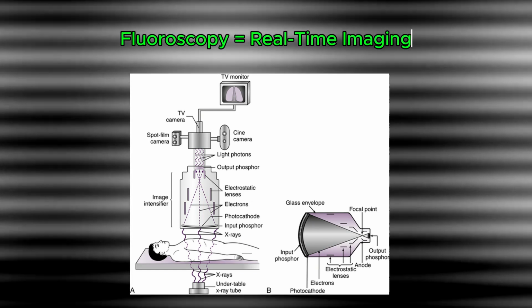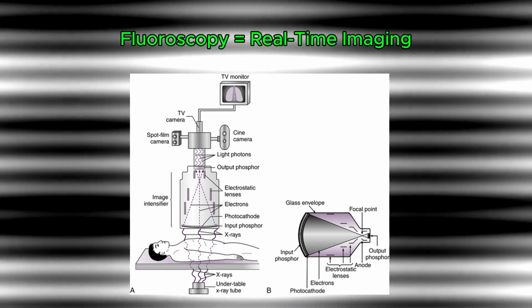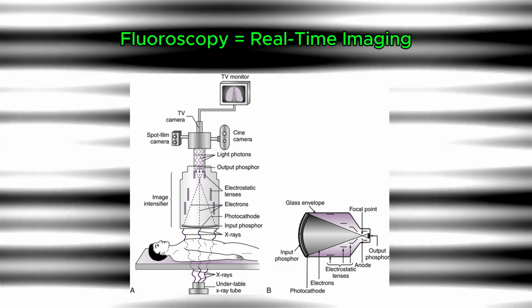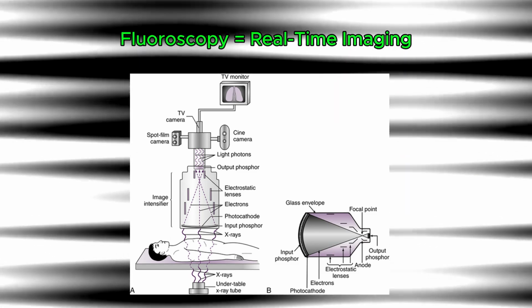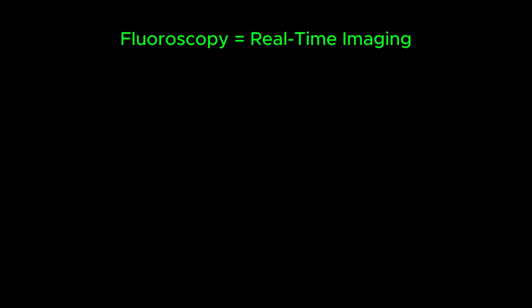Today we're going to be breaking down a major concept in radiology, fluoroscopy. This isn't just about taking a picture, this is about watching the body in motion live. Whether you're a student preparing for your exam or a tech brushing up on the basics, this video will help you fully understand how fluoroscopy works from top to bottom. We'll cover everything from what it is to how it evolved to how we see that glowing image on the screen in front of us.